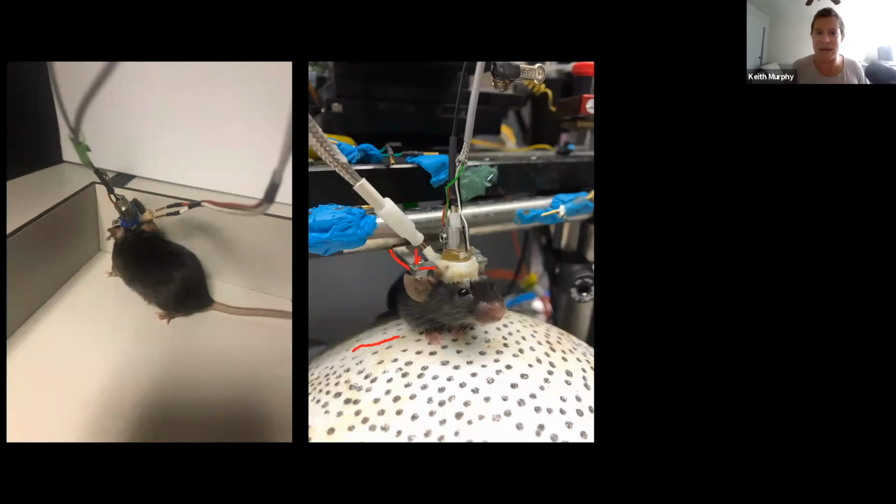And you can imagine we could add other ultrasound systems in on the side, or we could add a confocal lens here, as Kim does in many of her studies, fun things like that. And that's why head fixing an animal could be useful.